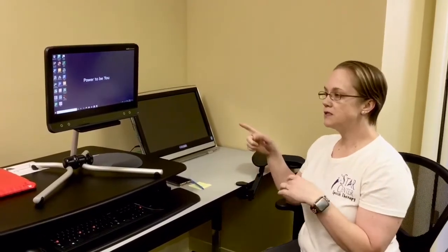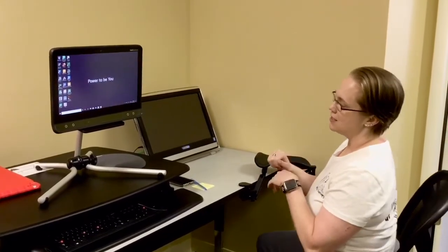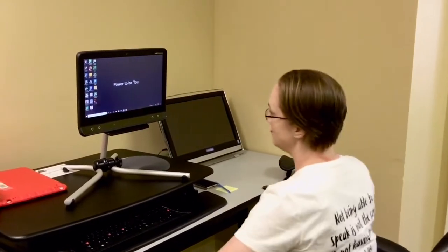Okay, so I mentioned when we were talking about access methods, eye gaze. This is our device that we keep on hand that has eye gaze. Lamp Words for Life, the company that produces that, PRC, they have their own devices and their own eye gaze model. This one is Tobii Dynavox, so the app that you've already seen, Snap Core First, we're going to see it again. We're going to see it on this device that utilizes eye gaze. So I'm going to scoot over here in front.